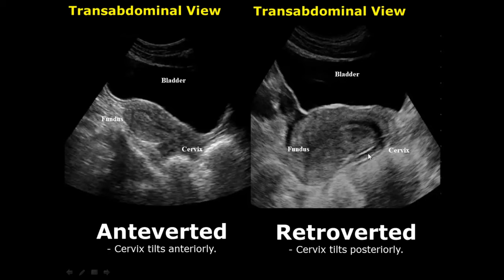In the retroverted uterus, you can notice the cervix is facing posteriorly or downwards in this image. Again, there is no noticeable bend of the body of the uterus, so we do not comment on it.